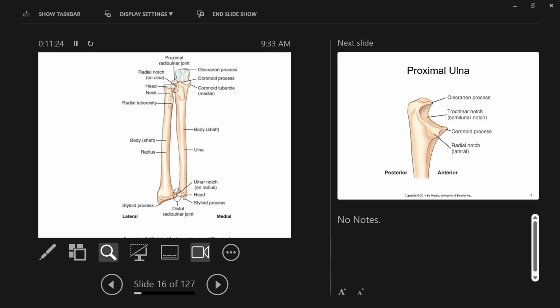But in an adult, let's look at a lateral elbow from an adult, compared to the lateral elbow in that child. Open plate, black line here, no black line there. That person's epiphyseal plate has fused. Once this line fuses and becomes bone, we're just going to call it the epiphyseal line. So I'm going to put a label to that.